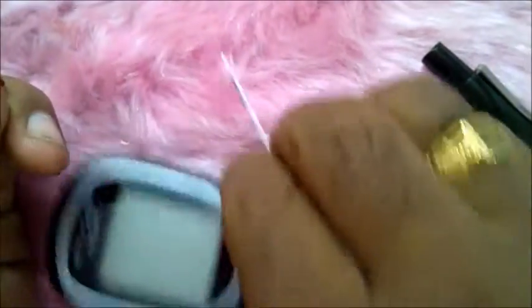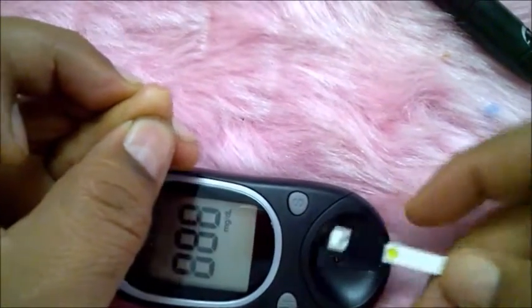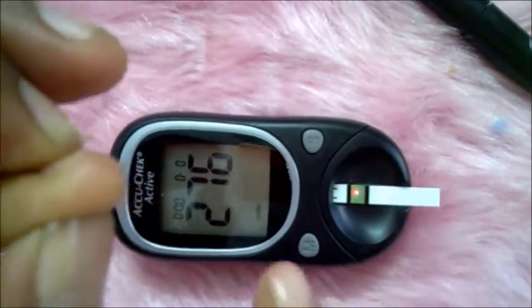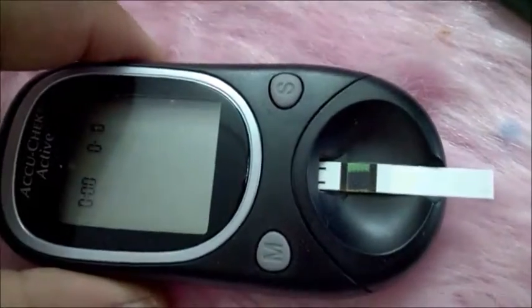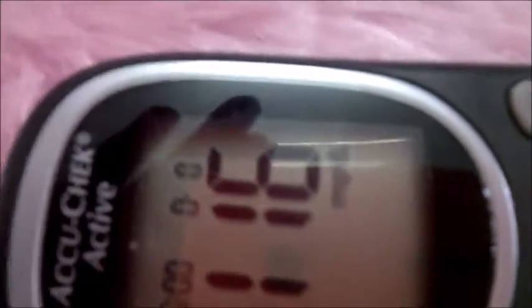Take this strip — it was on the wrong side. Don't insert it like that; reverse it. You should see the arrows up. The red light starts blinking and you get a sign of a drop on the screen — that means you should now put the blood drop on the strip. I am doing it here, and after waiting a few seconds, you get the reading: 116 is the sugar level.